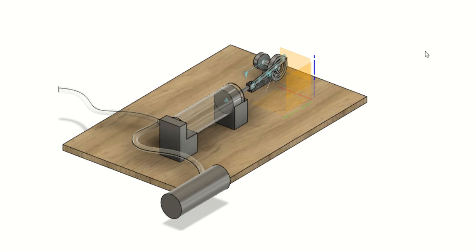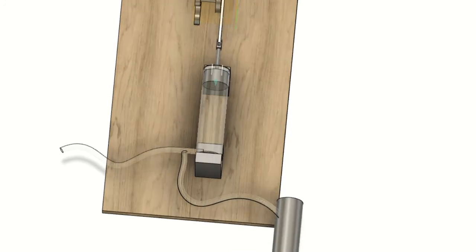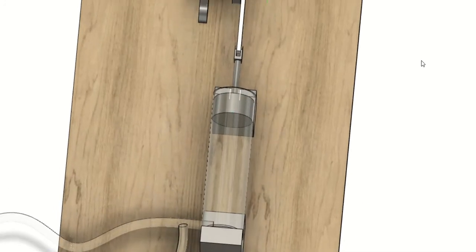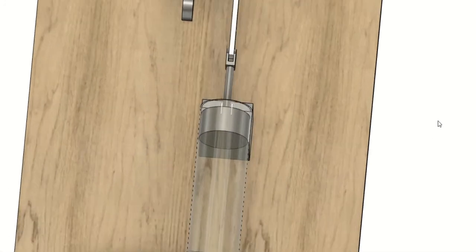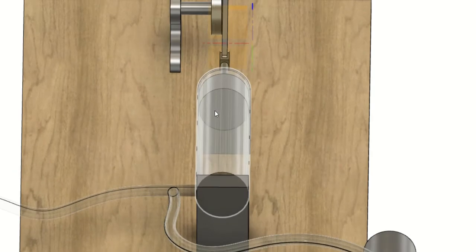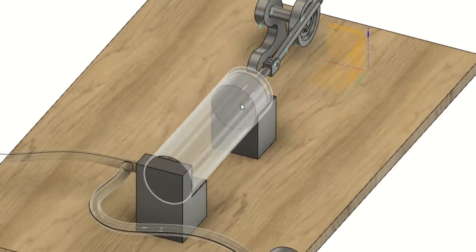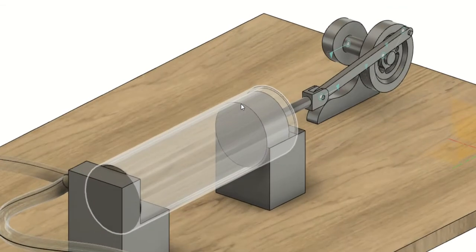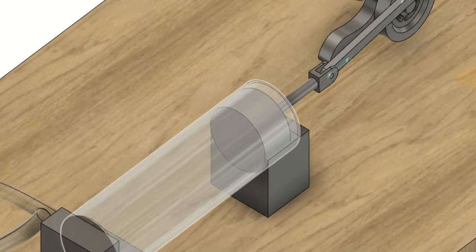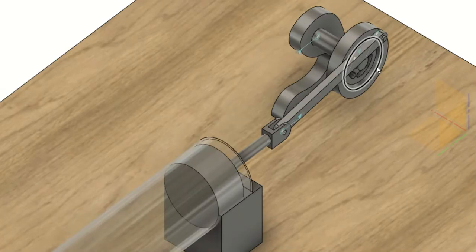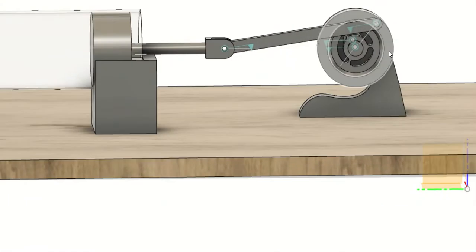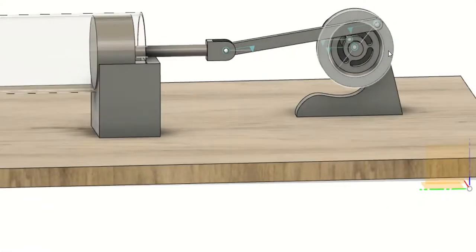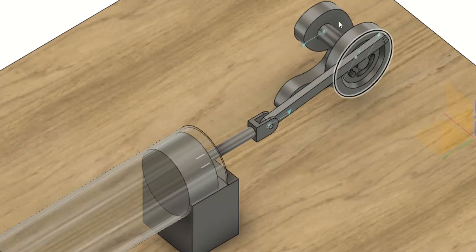Alright, so this is the CAD drawing of the ventilator I was working on. This is the cylinder with a diameter of 9.6 centimeters, so the radius would be 4.8. Then you have the wheel which will be powered by the motor - I'm not showing the motor here.